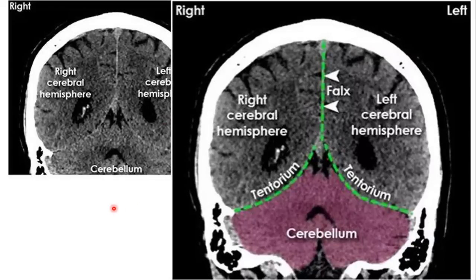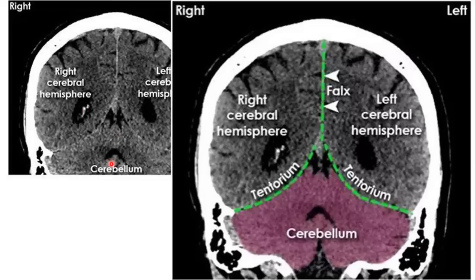On coronal reconstructed images, we can see the right and left cerebral hemispheres with the tentorium cerebelli separating the cerebrum from the cerebellum. At the attachment site of the falx cerebri to the midline, there is a whitish structure representing the superior sagittal sinus, where venous blood drained from the brain collects at the root of the falx cerebri.